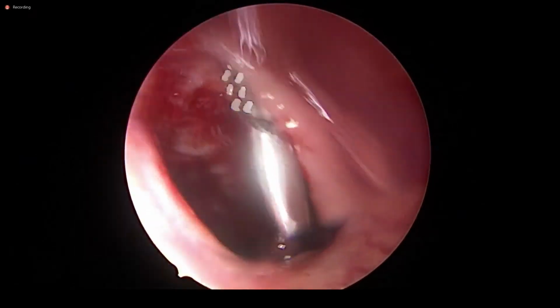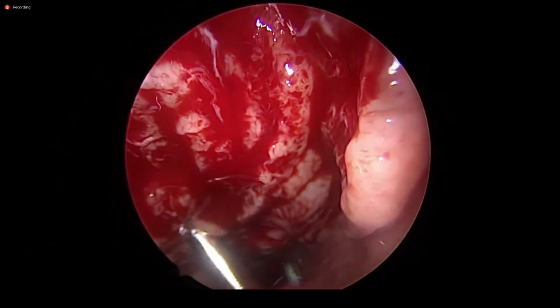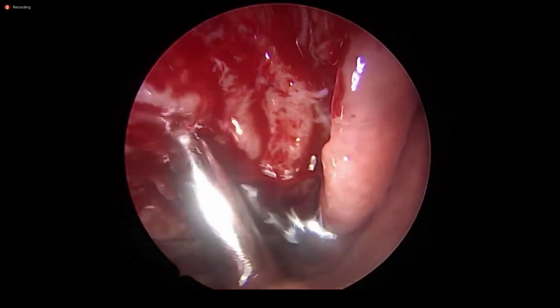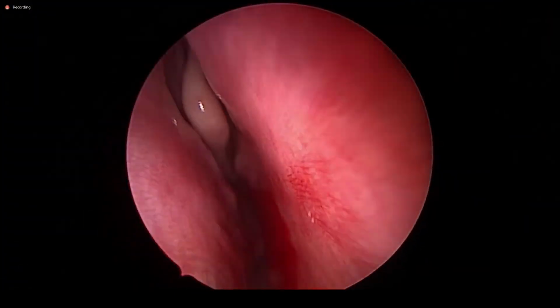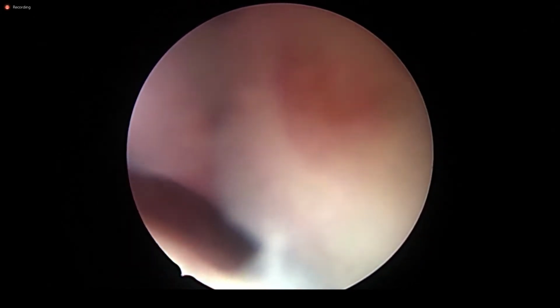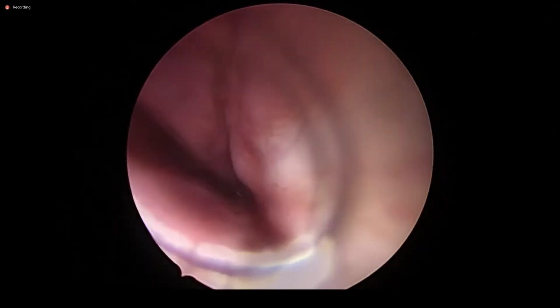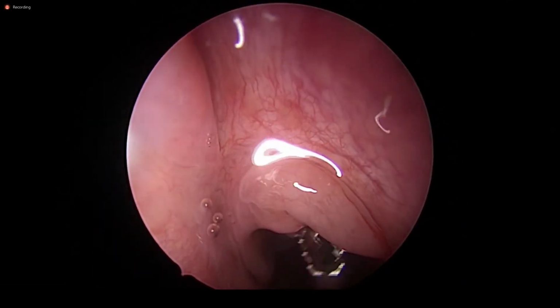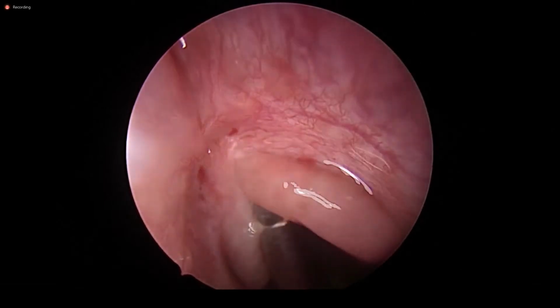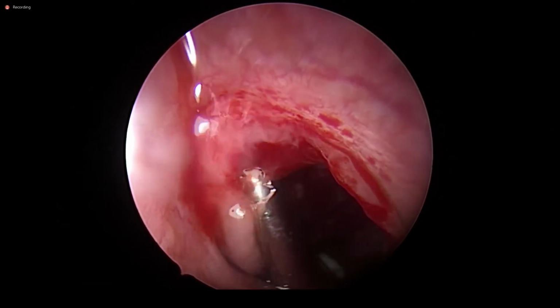The only disadvantage of this technique which I am going to show is this minimal bleeding, which is not going to give any problem to the patient as it is too minimal. But still, the proponents of the coblator can say that they can do the adenoid almost bloodless, but doing that, they'll end up damaging a lot of perimysium and the muscles behind, which is not acceptable at all. See from the opposite side. This is luminal clearance.